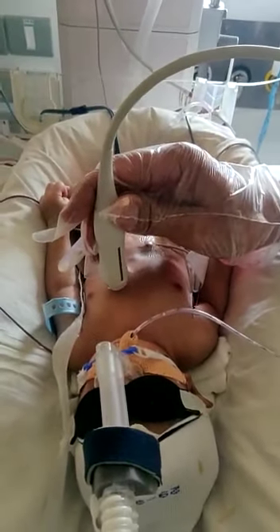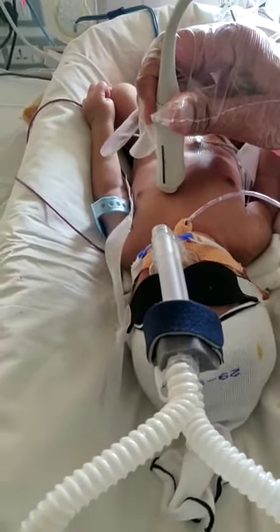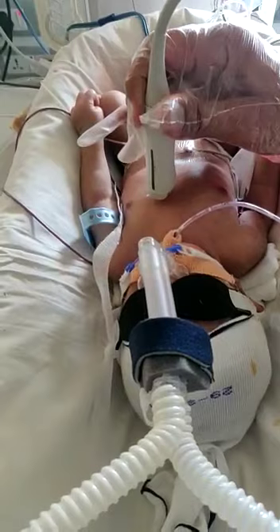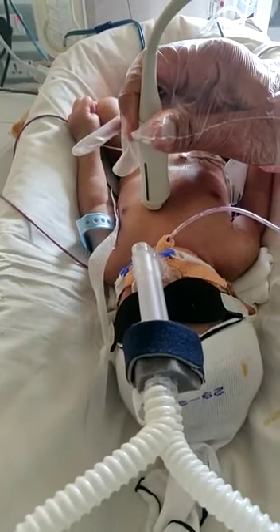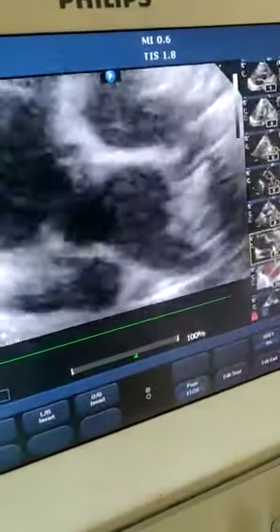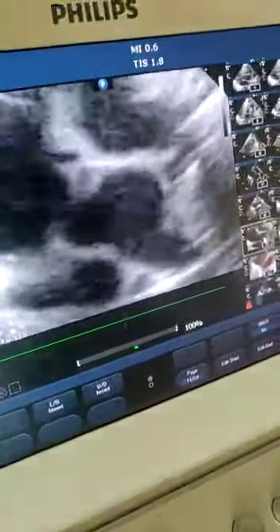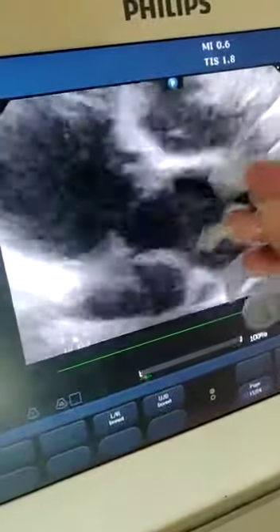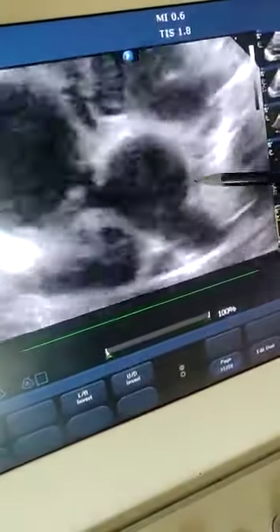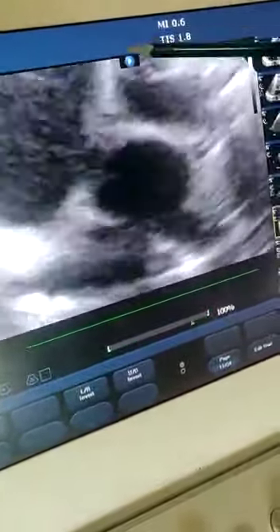Now having appreciated the parasternal long axis, I will rotate the probe 90 degrees. Same position — second intercostal space on the left side — with the marker facing to the left shoulder joint. You can appreciate the great vessels on the screen. This is the transposed great vessels view on short axis. Normally you see the aorta in the center, and the pulmonary vessels are anteriorly placed. But here the aorta is placed anteriorly and the pulmonary artery is placed posteriorly.